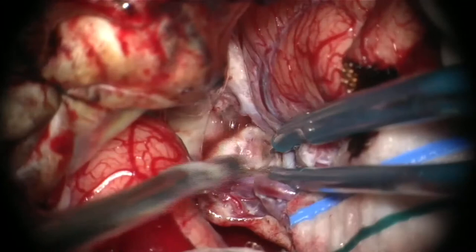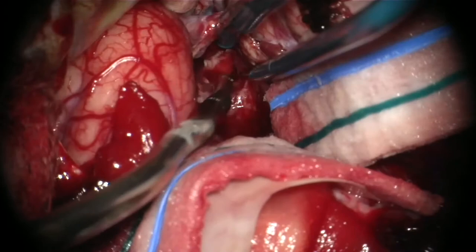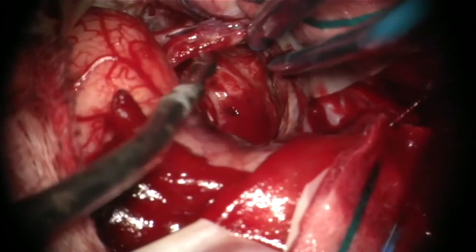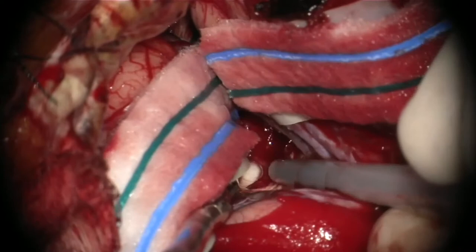Now I open the anterior aspect of the uncus and I debulk it. I can see the oculomotor nerve. And I can work from outside the uncus and from inside the uncus. I'm just going to leave the pial surface to protect the MCA branches and the lenticulostriates that run medially.